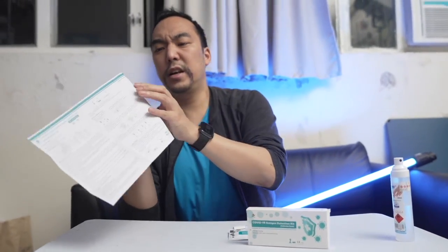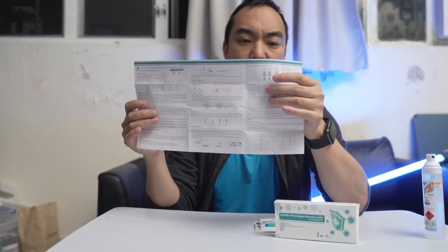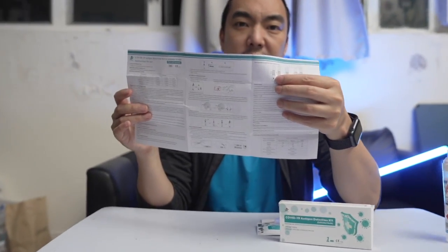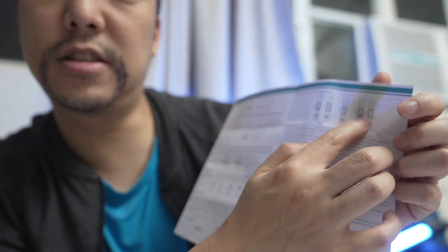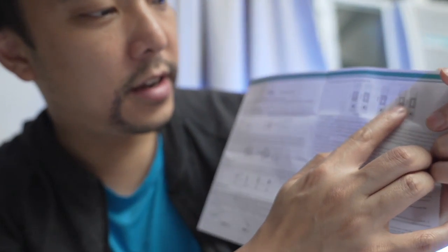Alright, anyway. If you have a C and a T, then you've got COVID. If you only have a C, then you don't have COVID. But it's very confusing because you think that if you had a C, that you'd have COVID. But a C means you need the T. T for tested to have COVID. But C is... Now it's very confusing. Anyway, you don't want to get the T. That means you tested for COVID. But if you get the C, you don't have COVID.